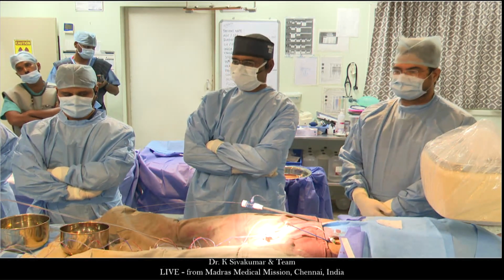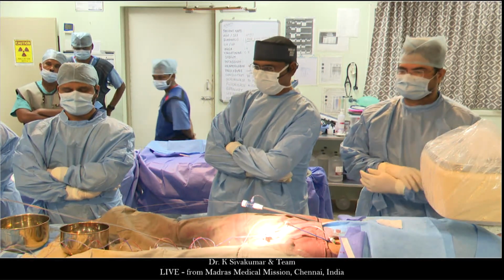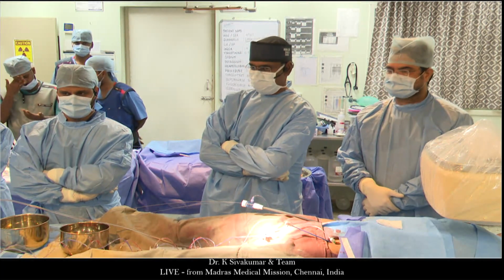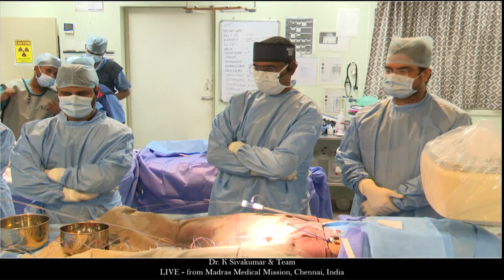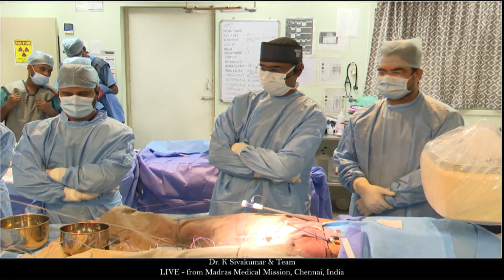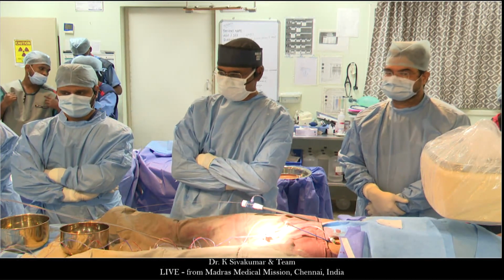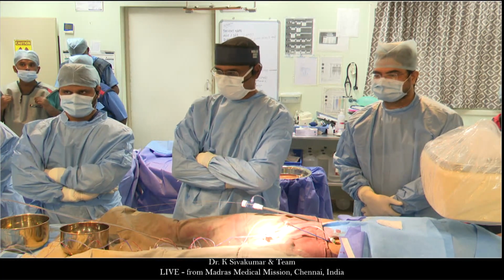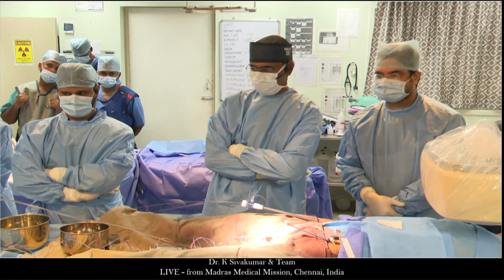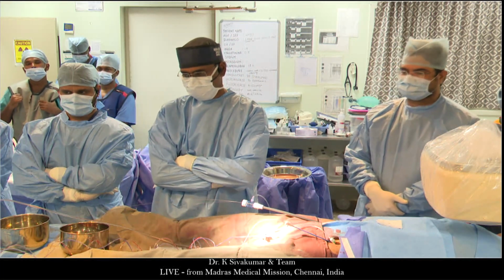Okay, thank you. Huwaida? We would consider it in an older patient, but we have not been doing it in younger patients. I think the upper pulmonary vein is pretty small, so by MRI you can estimate how much flow is coming from it, and just don't occlude it. Dr. Giorgio? Exactly, that's what we would do. We would discuss, of course, all these patients with our surgeons, so we think this is a team decision how to treat them, but we consider older patients for this treatment, and we would treat this patient, I think, interventionally as well.